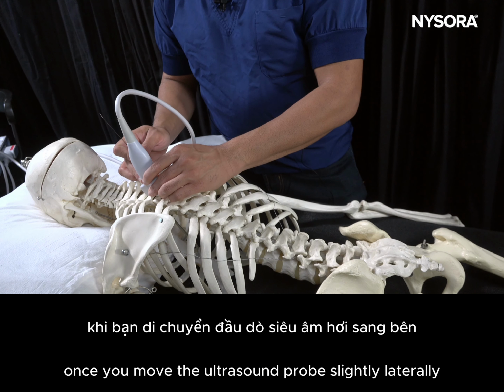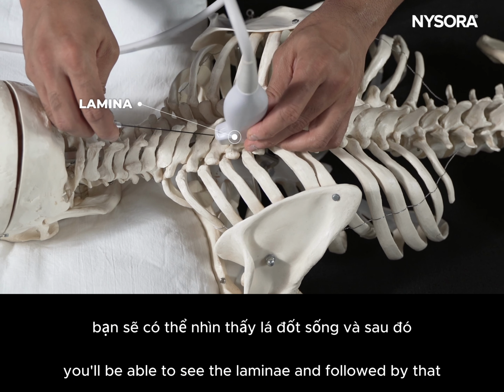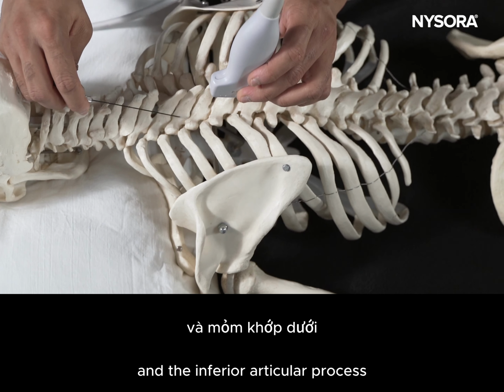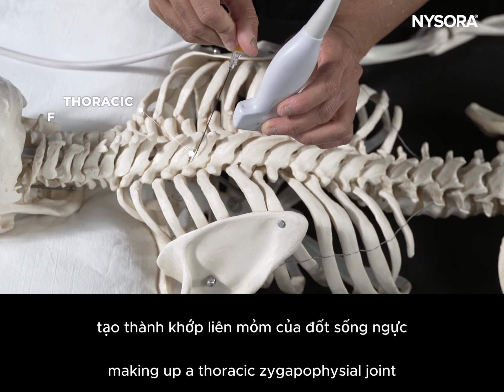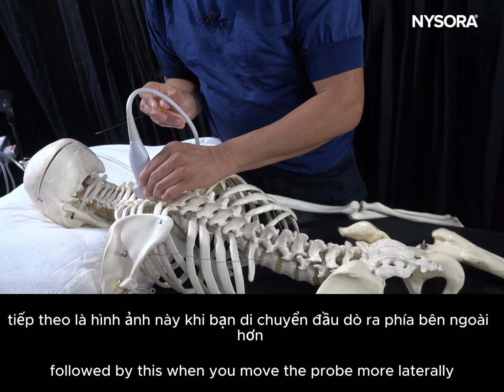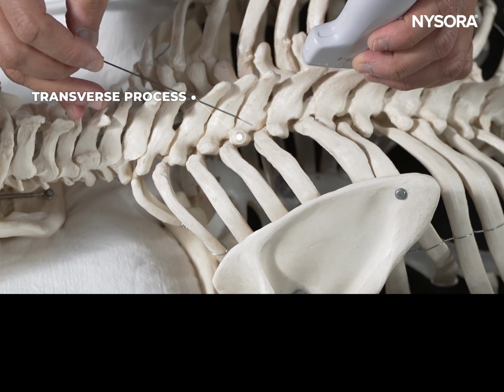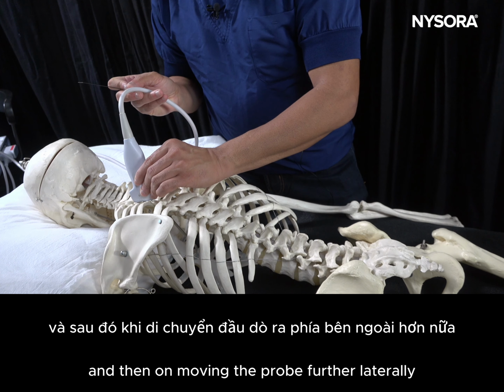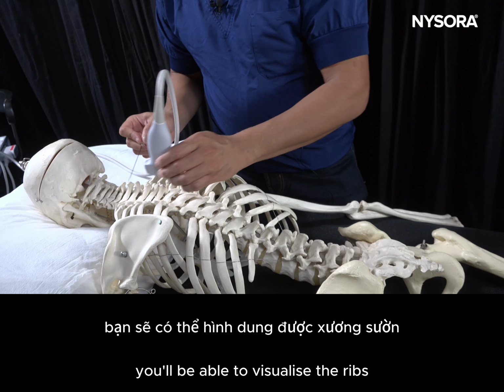Once you move the ultrasound probe slightly laterally, you'll be able to see the laminae, followed by the superior articular process and the inferior articular process, making up a thoracic zygapophyseal joint. Followed by this, when you move the probe more laterally, you will be able to see the square-shaped transverse processes, and then on moving the probe further laterally, you'll be able to visualize the ribs.